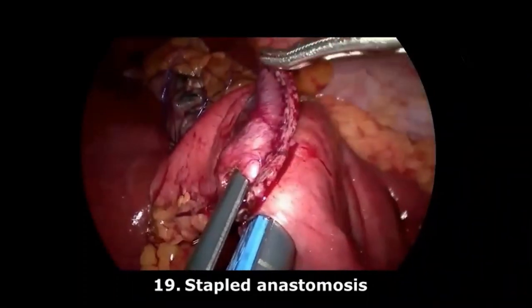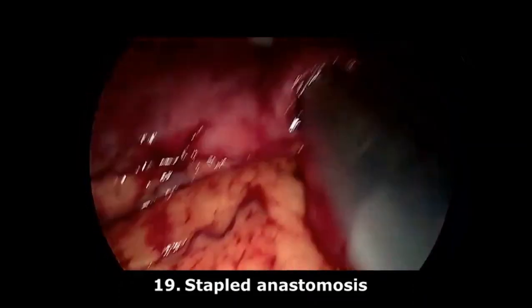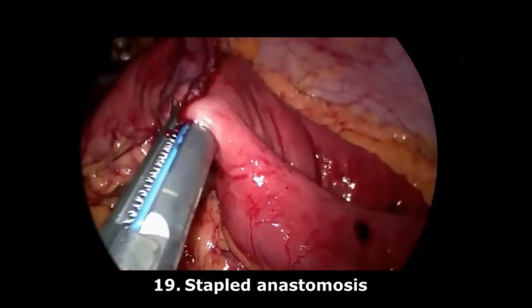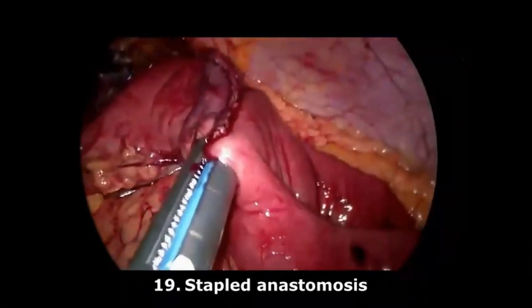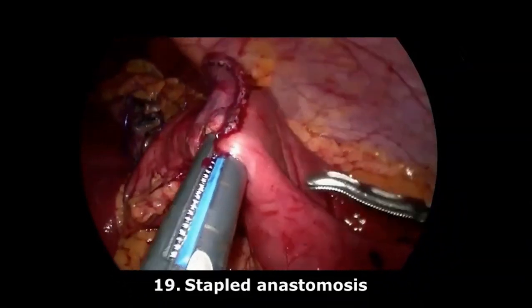Now, this stapled anastomosis has proved to have less leak rates and less stricture rates, according to a famous fellowship project done about SADI-S and duodenal dissection and duodenal switch operations. Thank you.